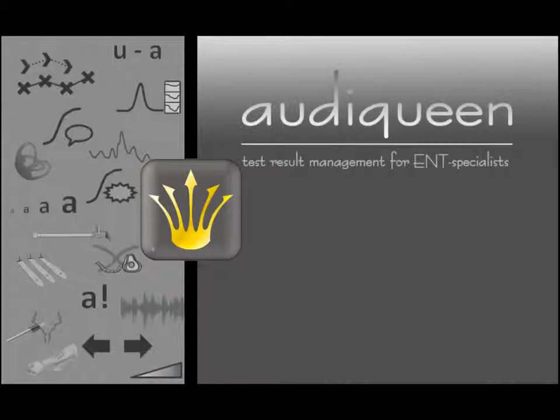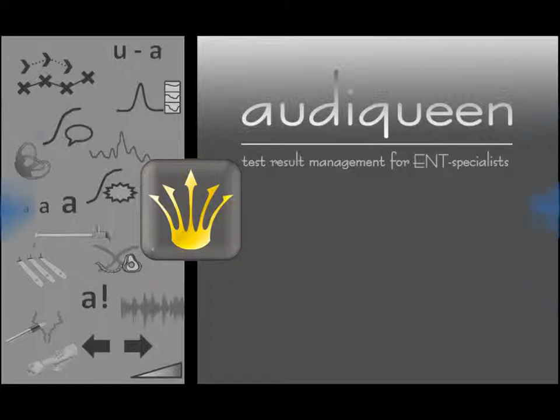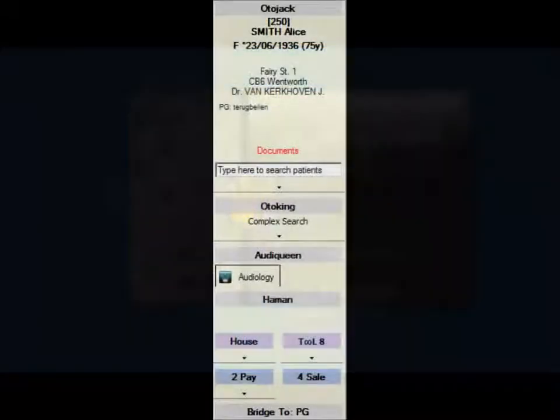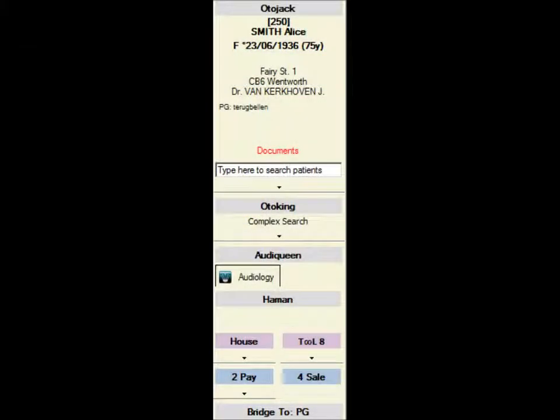Audiqueen is a software application to manage many different test results for the ENT specialist. It runs either as a standalone application, or it can be opened with a button in your electronic medical record.